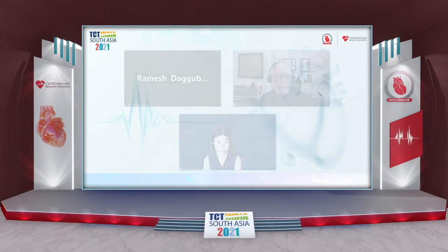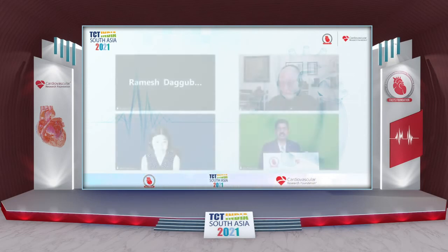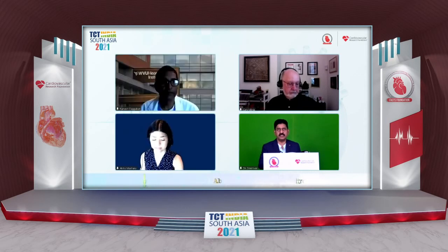Dr. Ramesh, thanks for an excellent talk. You highlighted the usage of virtual histology in IVUS, especially in acute coronary syndrome situations. Do people use virtual histology regularly? I thought it was hyped a lot, but not much used. No, it is actually very useful, and we do use it regularly because it's just pressing a button.